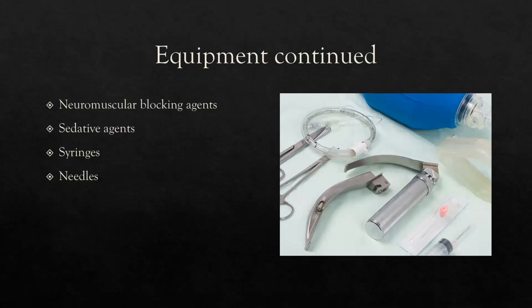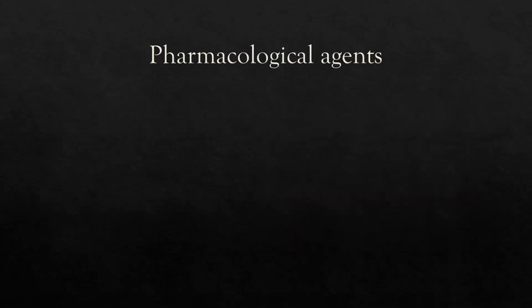We want to make sure that we have our neuromuscular blocking agents, our sedative agents, our syringes, our needles, our flushes, our IV stuff already set out. And when we're drawing our medications up, we're going to lay it out and put it in the order that we are going to push those meds. Don't just throw syringes out there because we can get the order wrong. So place those syringes in the order that you are going to push them.